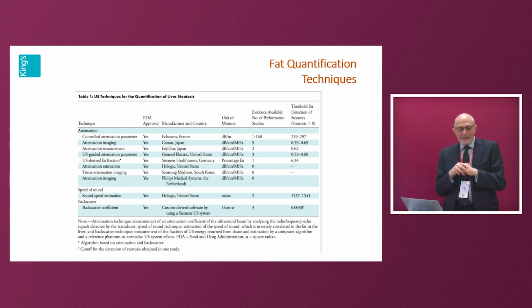So if you say to the patient, I've looked at your liver today, you have 14.82% fat. Run around the block, come back and see me next week, and we'll see what it is. The patient comes in and says, well, it's 10.1%. You're doing well. See how the patient understands. And he goes out next door to the bar and has a few drinks, and he comes back and it's 14% again. Okay, so you have an interaction and the ability to get the patient to understand what's going on.